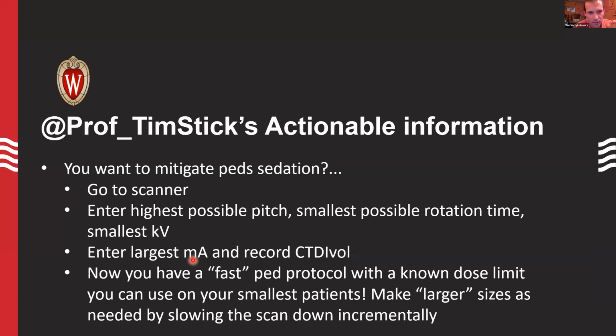Go to your scanner, right? Enter the highest possible pitch value, the smallest possible rotation time, the smallest kV. Let's build our pediatric newborn protocol. Enter your largest mA and see what your scanner can do for output. And if you know what kind of doses you expect for your pediatrics, now you know what size pediatric that fast protocol could go up to from doing this simple little exercise.